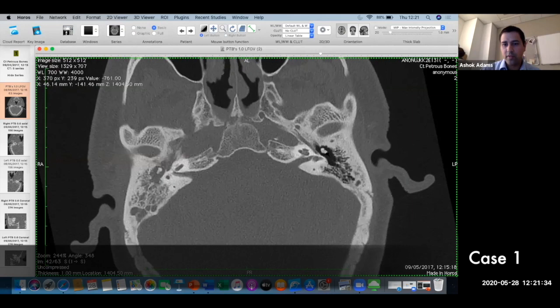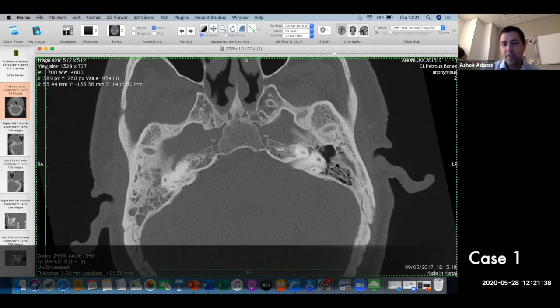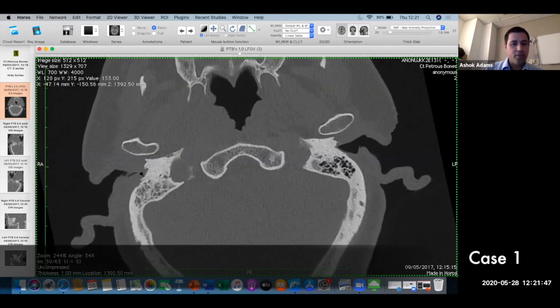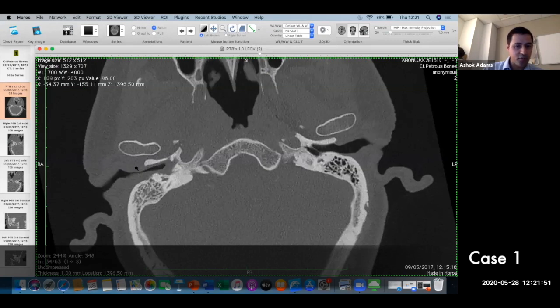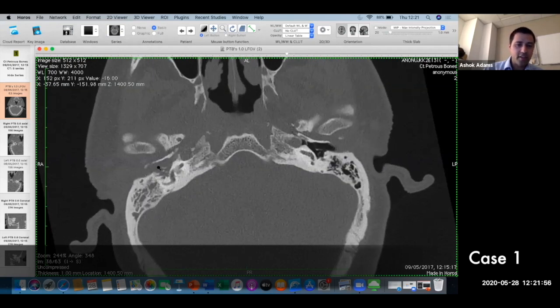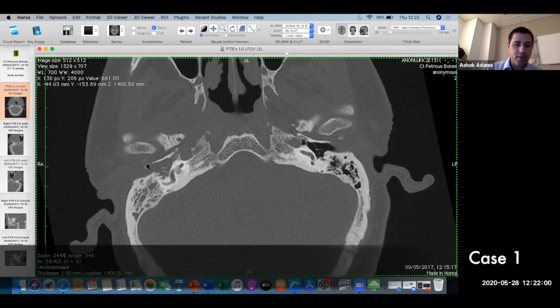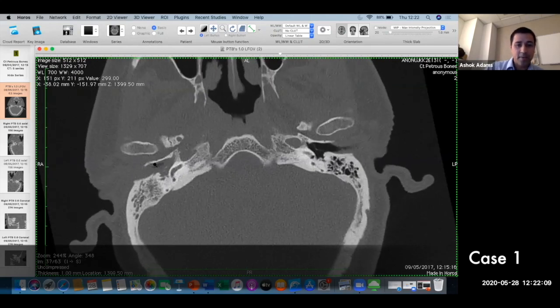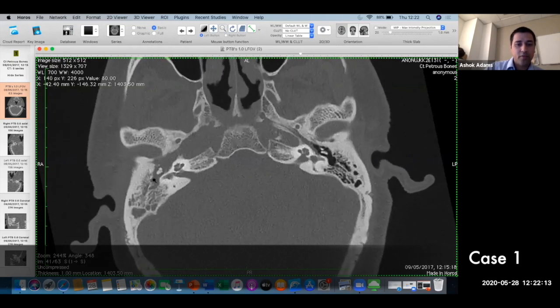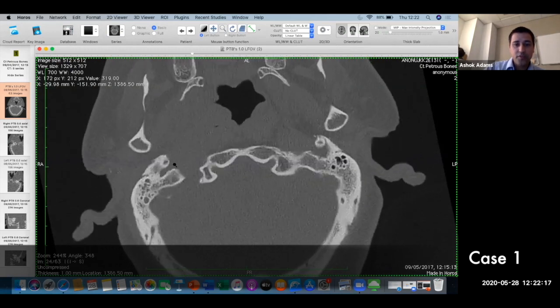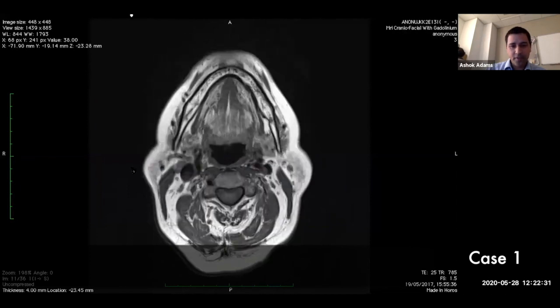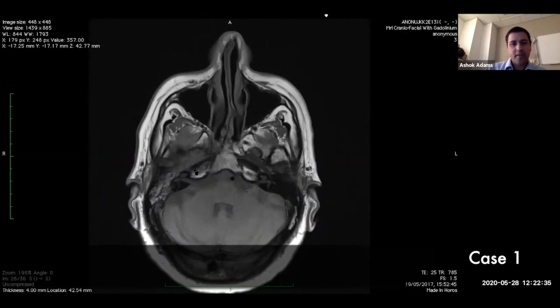With a poorly controlled diabetic with ear pain, your thought process is otitis externa. You can see some soft tissue thickening in the external auditory canal, and some of the bone has been nibbled away - bony erosive change. This is a necrotizing as opposed to simple otitis externa. All of this middle ear mastoid cavity is completely opacified. This is a temporal bone CT giving mainly bony information, so you supplement it with MRI - particularly if there's facial nerve palsy - to know the true extent of the process.